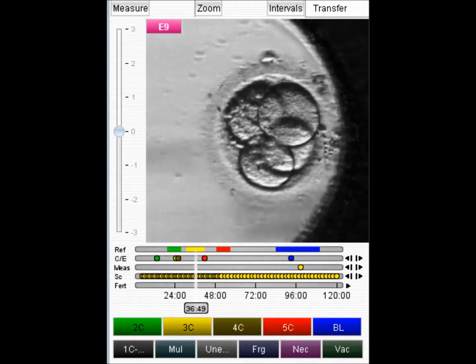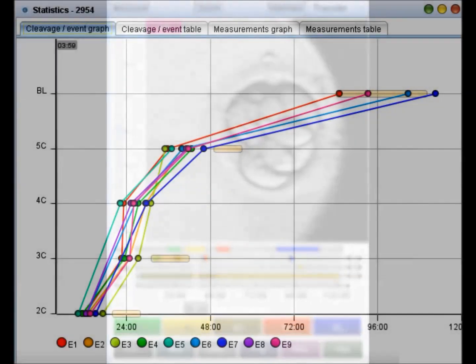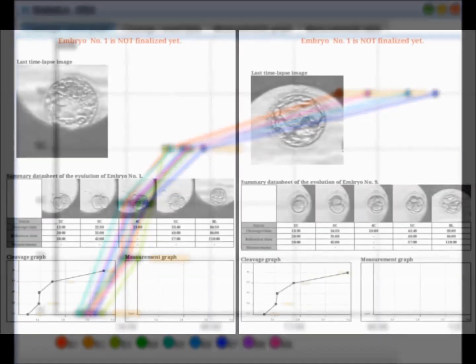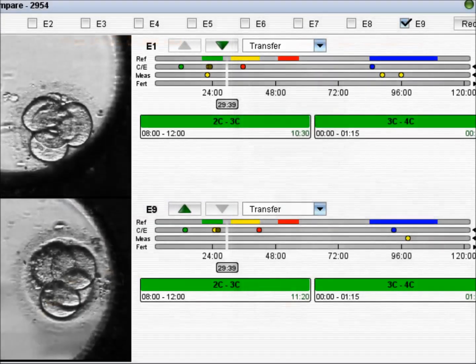Significant cleavage events are manually inputted into the computer and growth curves plotted for each embryo. Important information is gathered together which includes how the embryo looks, the size of each cell and the presence of any cell fragments, the growth curve itself and the presence of any abnormal growth event.